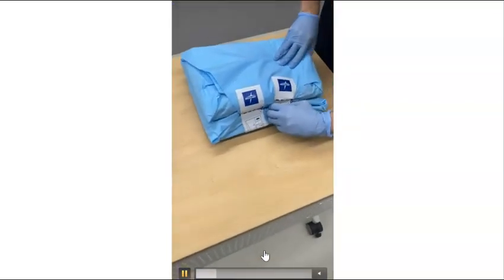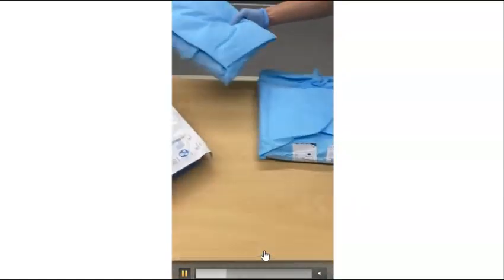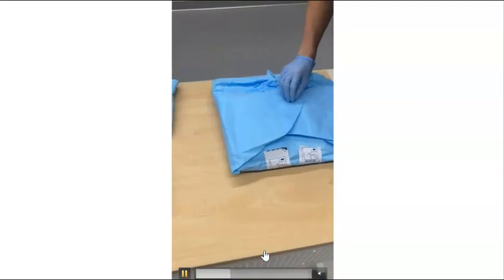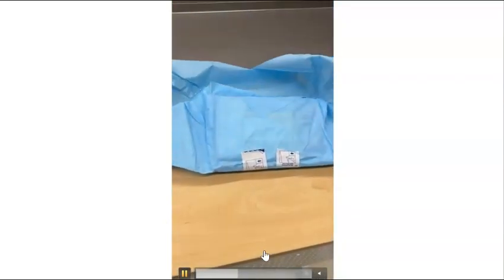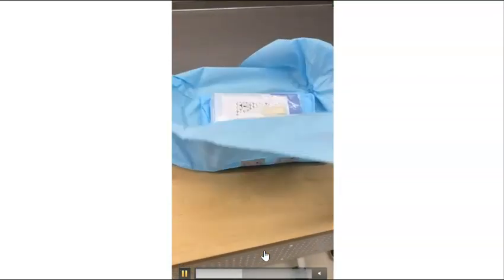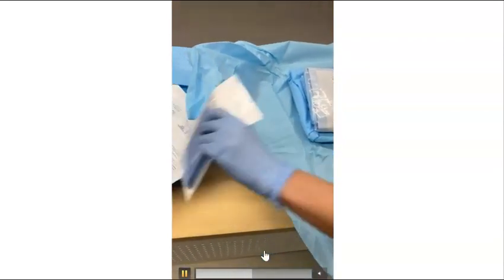First, we open up our line insertion tray. You have to be careful not to touch the inside portion as we are not sterile yet. Next, we will drop both our ultrasound probe cover and our CVC kit into our sterile field as demonstrated in the video.